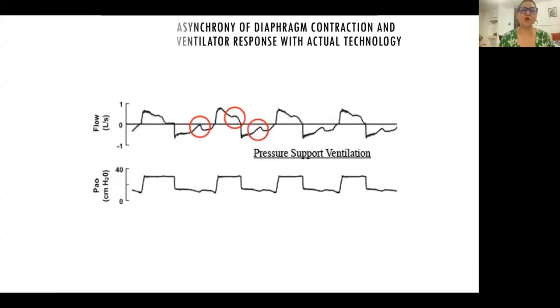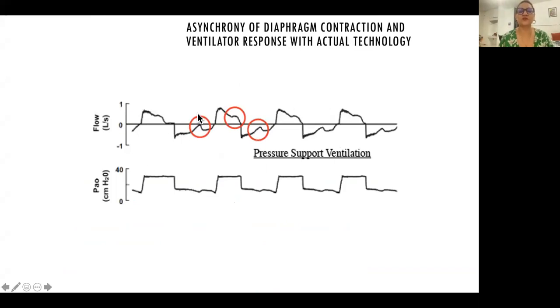So this is very important, and this is how you will see, if you want to look at the diaphragm contraction and the ventilator response, that there is asynchrony here and here.